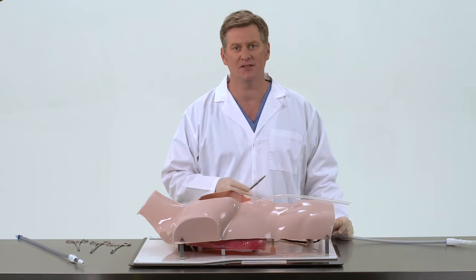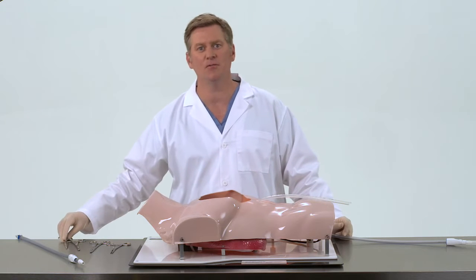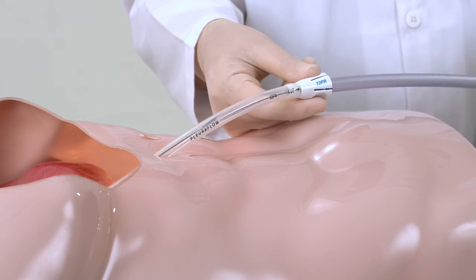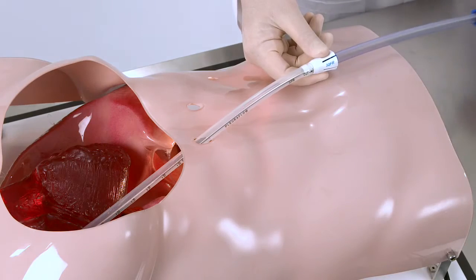The PleuraFlow system can be used in all standard drainage positions. However, when placing the chest tube, the most important point is that the chest tube is not kinked or does not have a high degree of curves so that the clearance wire and loop can easily enter and exit the chest tube. To achieve this goal, there are three technical considerations.